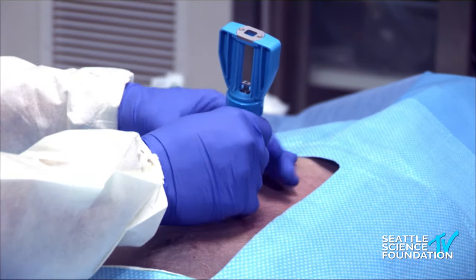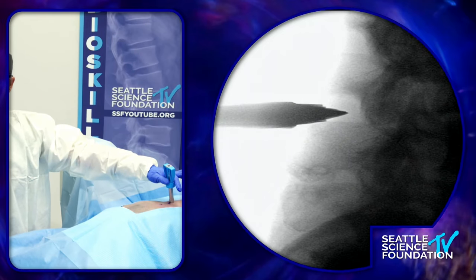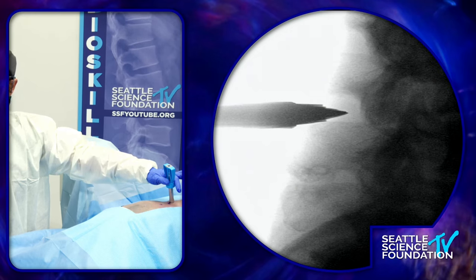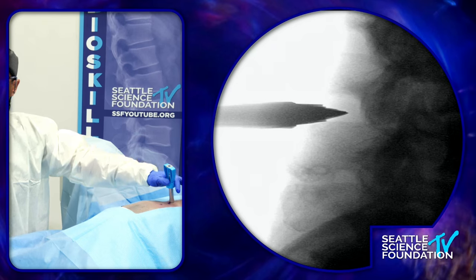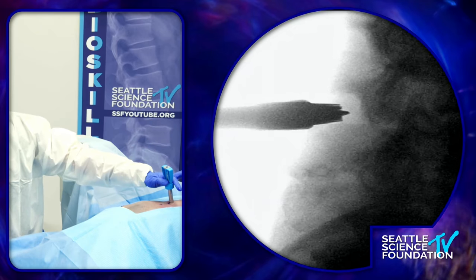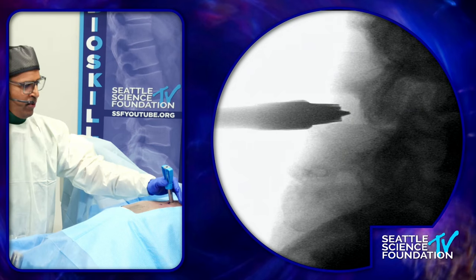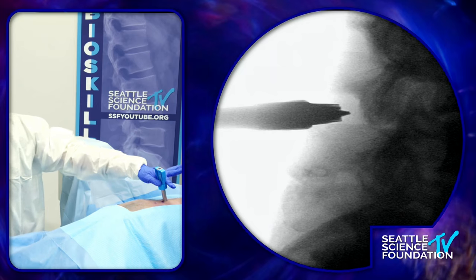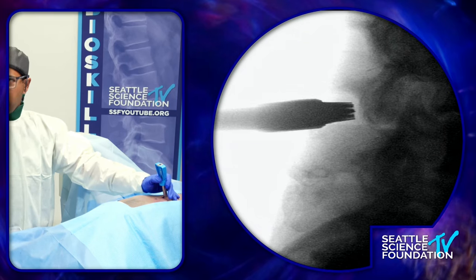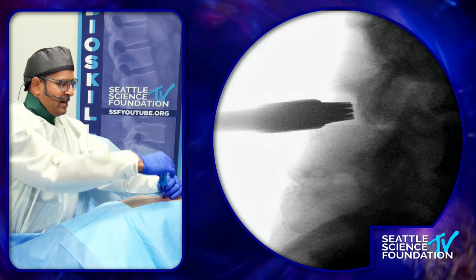After dilator one is in place, I take the cannula assembly — it's two instruments in one. There's an outer cannula, which is that big thick cylinder in the back, and inside there's a tapered cannula, historically known as dilator two. I'm trying to get dilator two — the tip of it — to the spinal laminar line. Dilator one comes back a little bit naturally; you can put your finger down and advance it, but you don't have to. Dilator two is just slightly short, but I can also look at the outer cannula and get it to about 30 percent across the interspinous space.